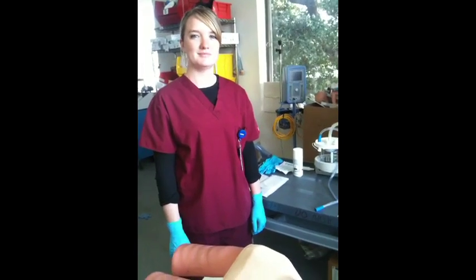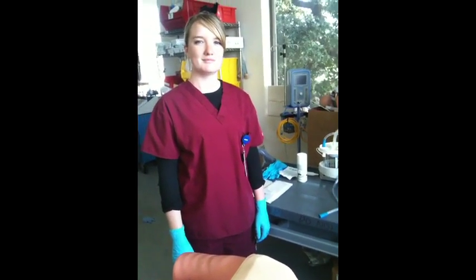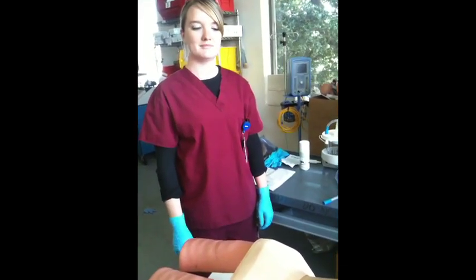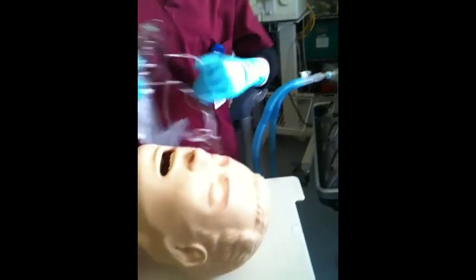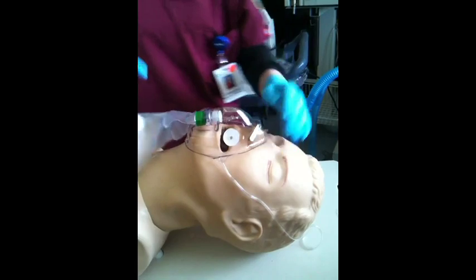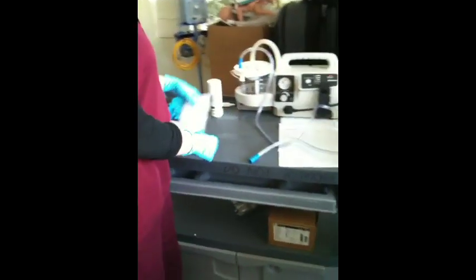The first step to NT suctioning would be to wash your hands and then put gloves on. After that, we pre-oxygenate our patient. So we're using a non-rebreather. Afterwards, we're going to start to get our kit out.